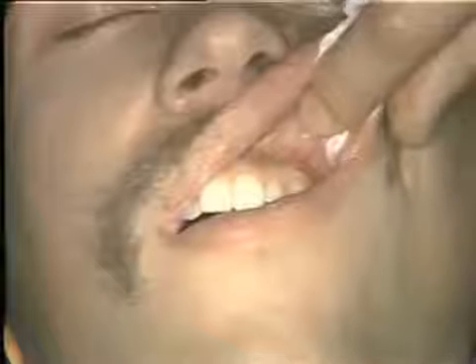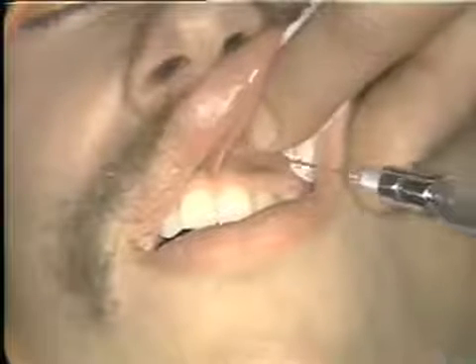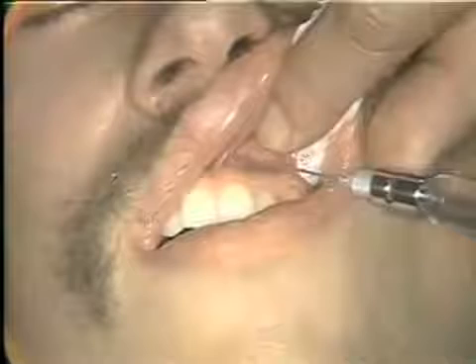Same technique, tissues dry, tincture of betadine, through the vestibular tissues against bone and aspiration, and again injection of a cc and a half of solution will very adequately anesthetize either the lateral or the central incisor tooth.